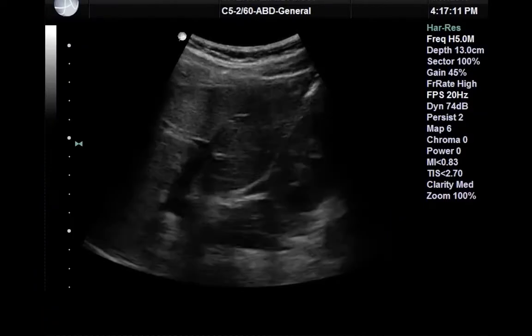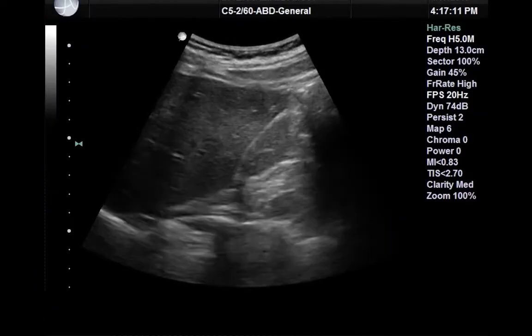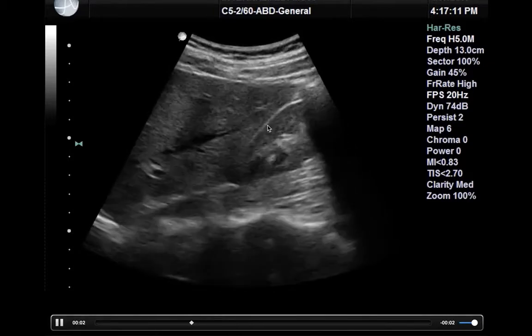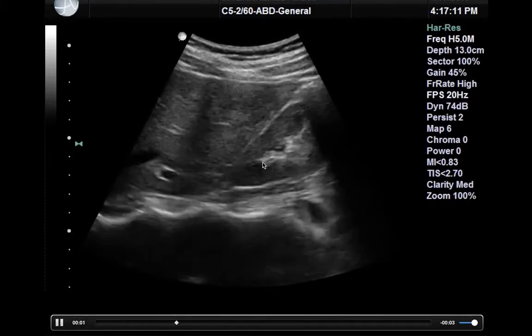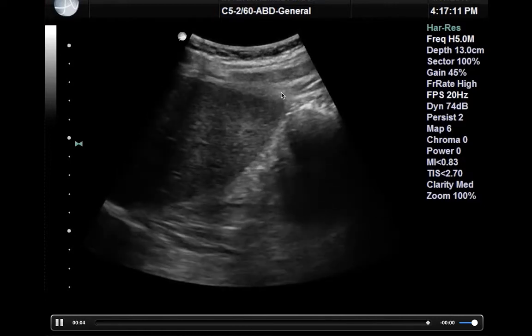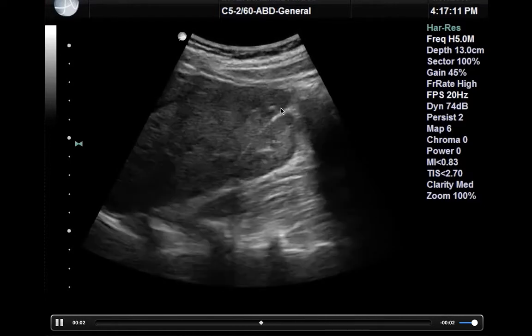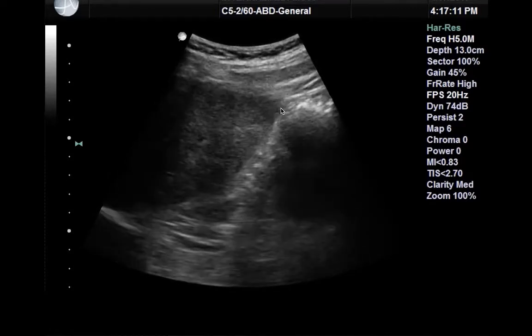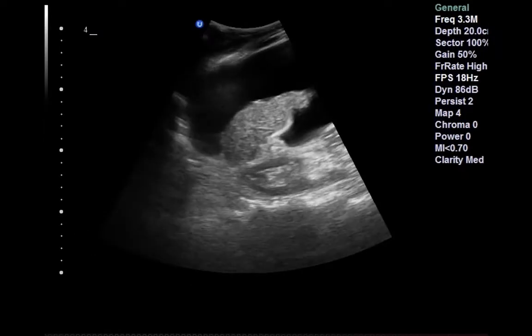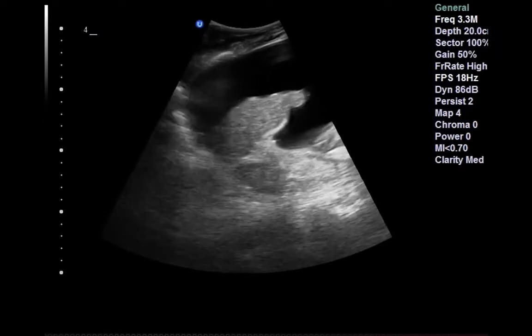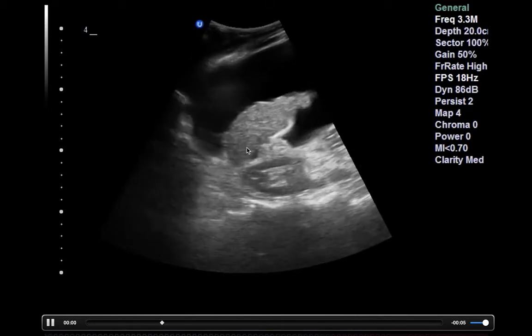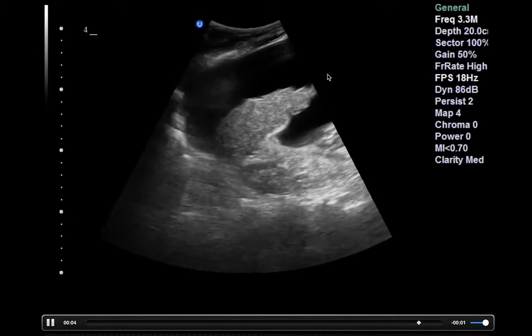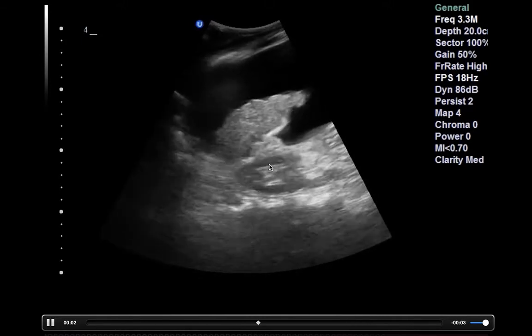Here's what a sweep through of that region might look like — you've got your liver, then sweeping through the kidney, and then you get a good view of the tip of the liver through the whole 3D structure. Here's a clip of what a positive scan might look like: a patient with cirrhosis and a fairly shrunken liver with a fair amount of ascites all around that area, with the kidney visible right here.